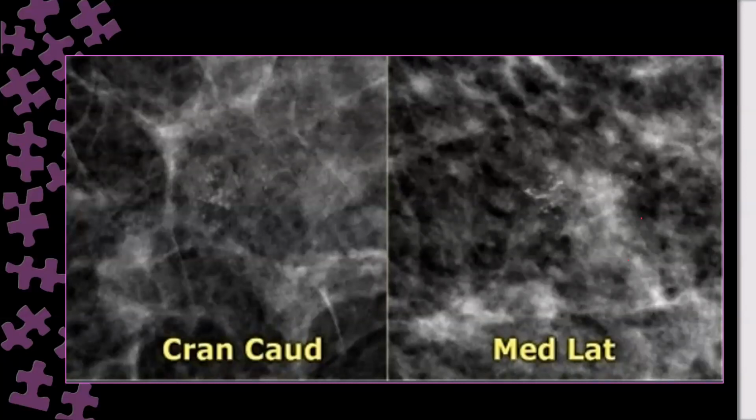And it looks like what? If you see this type of particles, can you see it here? Looks like what? It is arranged like what? Like a bag? No. It went like a line. Yeah. It became a little bit more sharp and more linear. If you look here, dots, but here more or less linear.